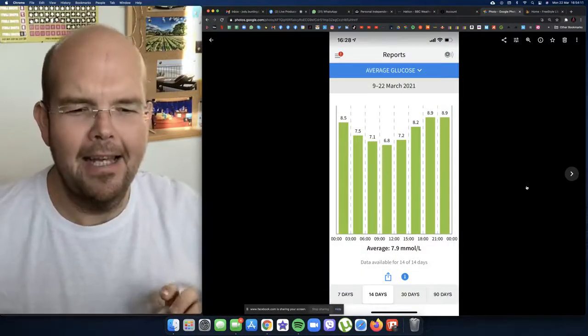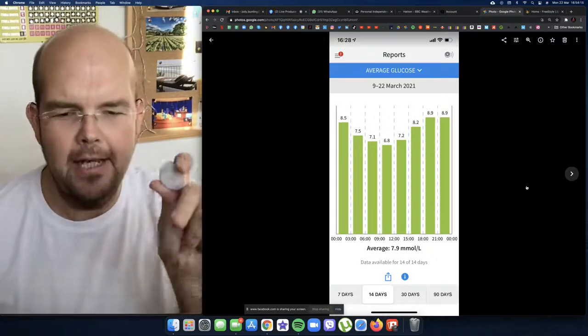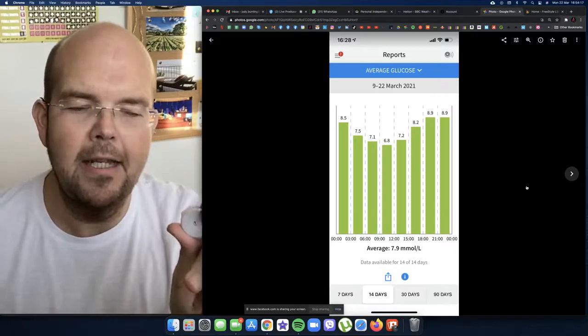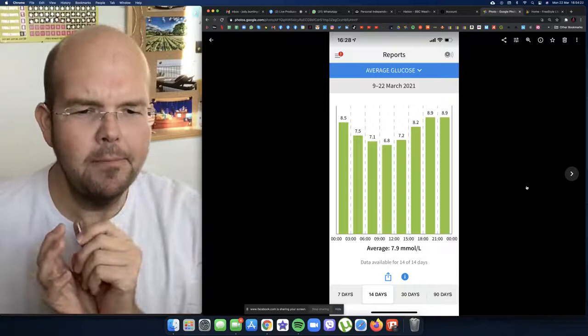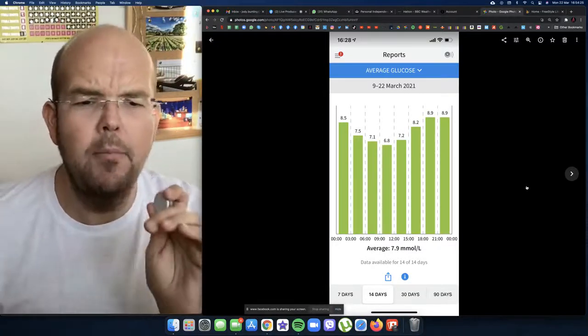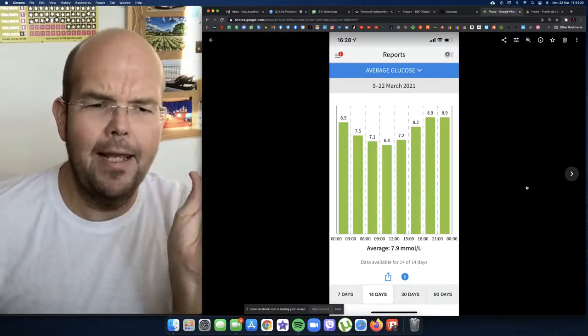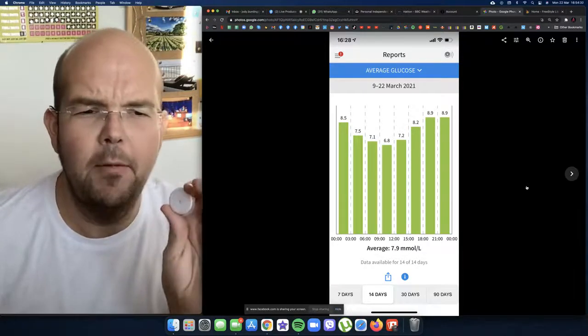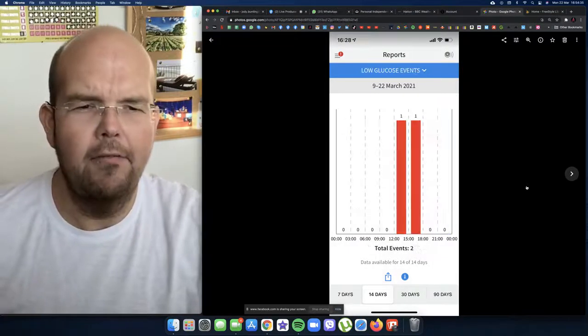My next slide is the average for the last 14 days. You can see at the bottom it says the last 14 days, and I'm completely in range. Generally around lunchtime, coming down to 6.8, and then quite late in the evening after the evening meal going to 8.9 — that was my highest average.